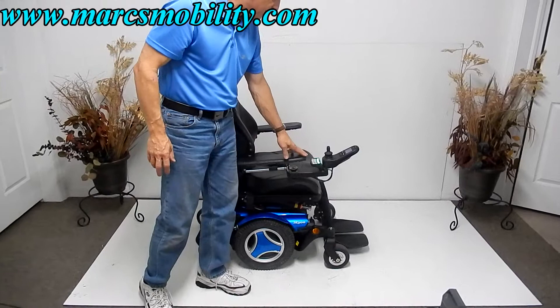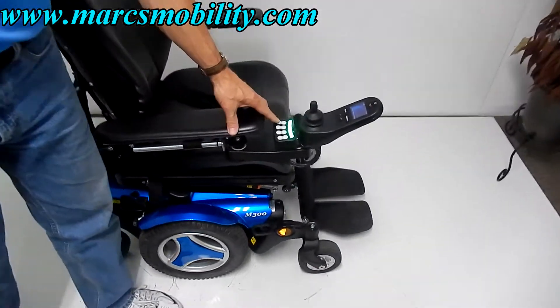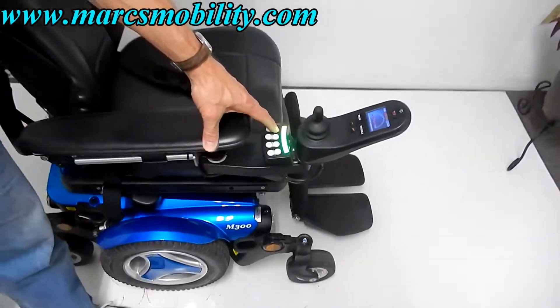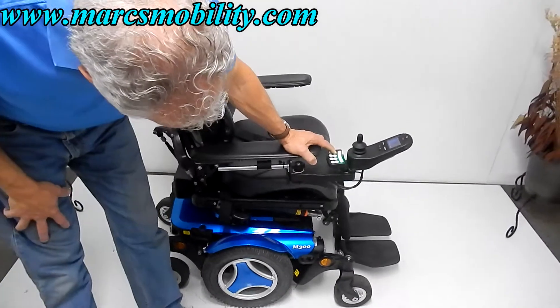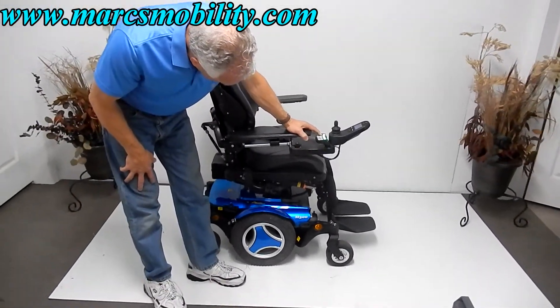The first thing I want to show you is how the seat goes up and down. Just hit the button over here and the seat will go up. This is your eight-inch seat lift right now going up. So this would be your seat lift right here.